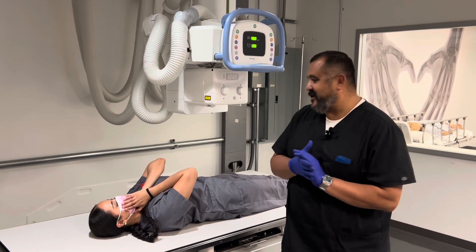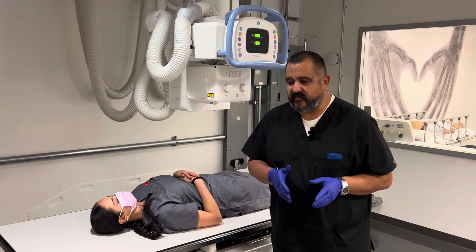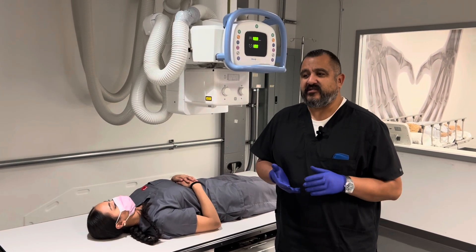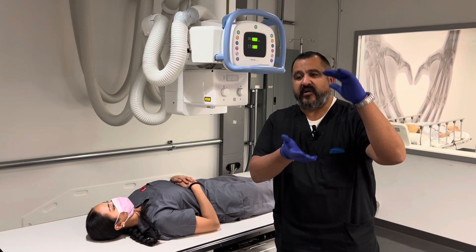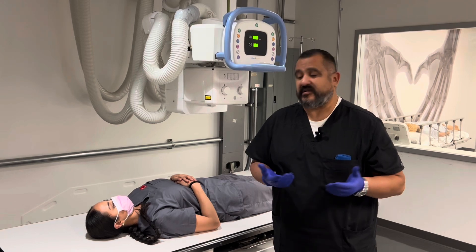Mr. Medine here. Today we're going to be doing the femur. Femur is kind of an interesting exam because there are two APs and two laterals. What that means is you have to do a proximal AP and a distal AP. You have to do a proximal lateral and a distal lateral. So there's a total of four projections on the average adult femur.